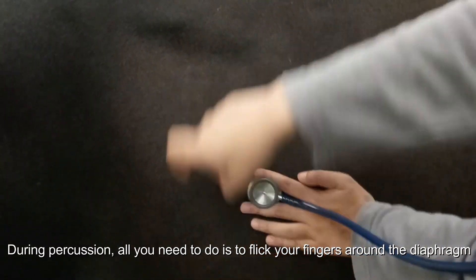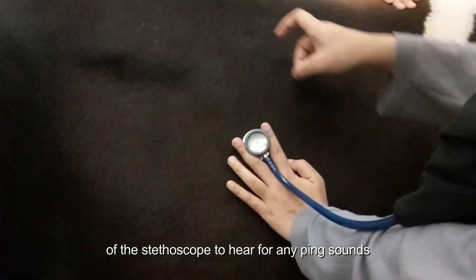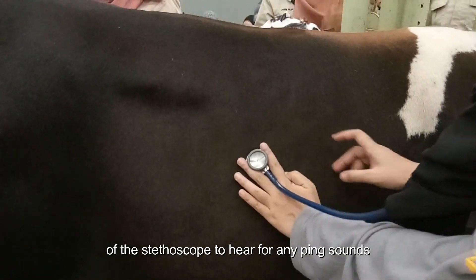During percussion, all you need to do is to flick your fingers around the diaphragm of the stethoscope to hear for any ping sounds. That is all from our group. Thank you.